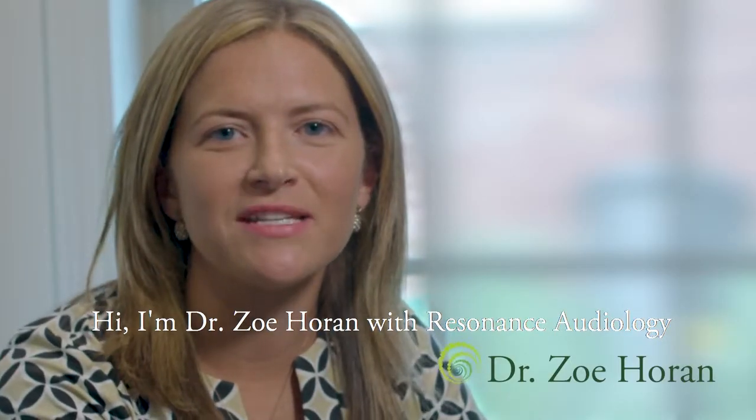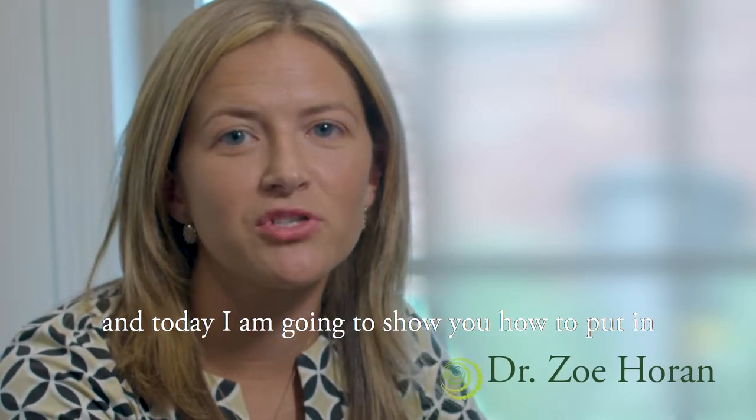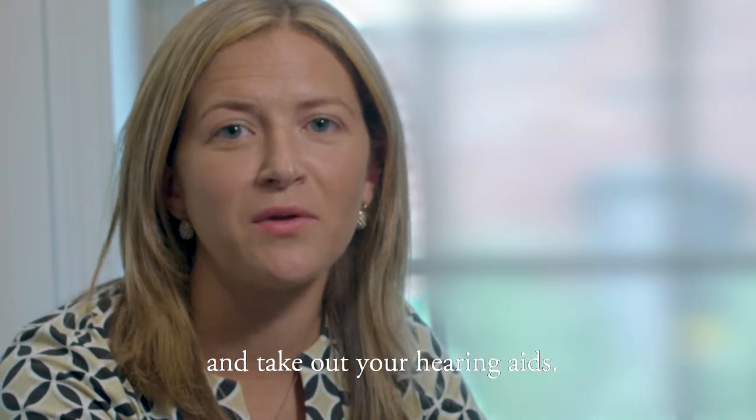Hi, I'm Dr. Zoe Horan with Resonance Audiology, and today I'm going to show you how to put in and take out your hearing aids.